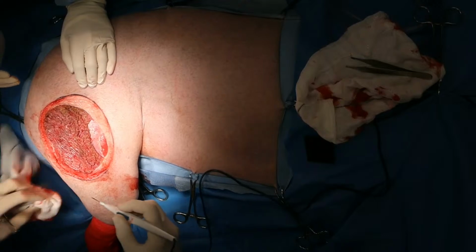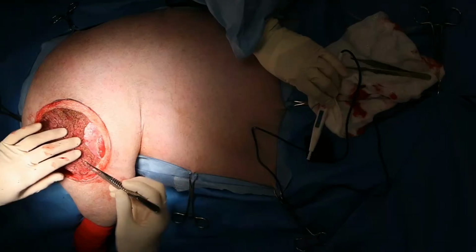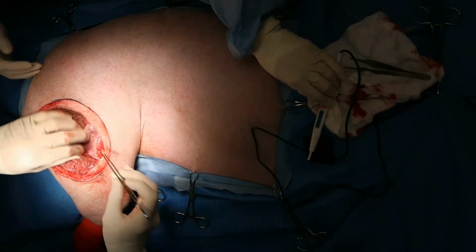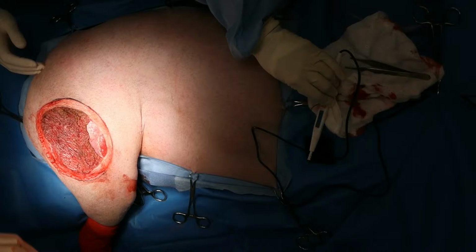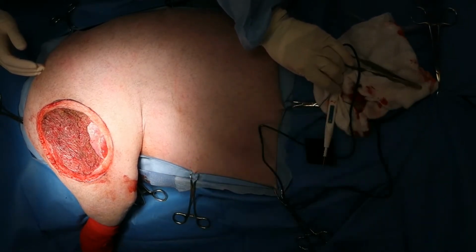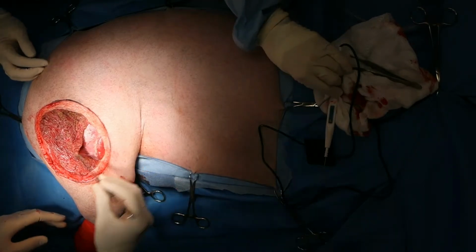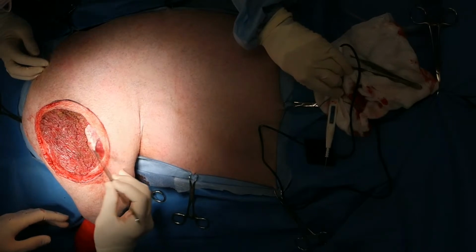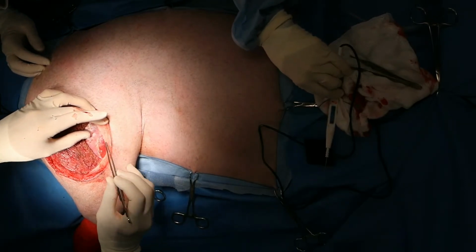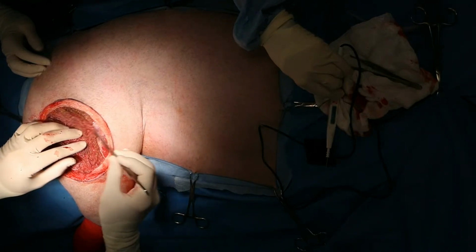So, very exciting. All right, so we've got this big wound here. We don't have to worry about toxicity, because the epidural had already passed. So I'll just go about 6 mils. All right, so we've got it. That's biceps muscle there. That's vastus lateralis fascia, and that's fascia lata right there. And so I'll probably just close that across like that.